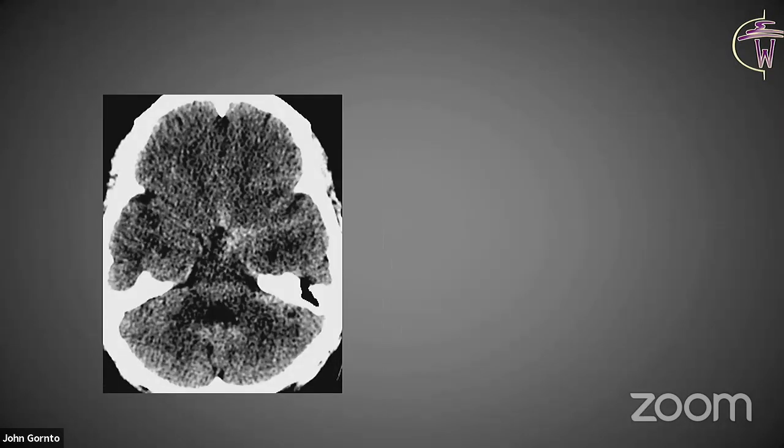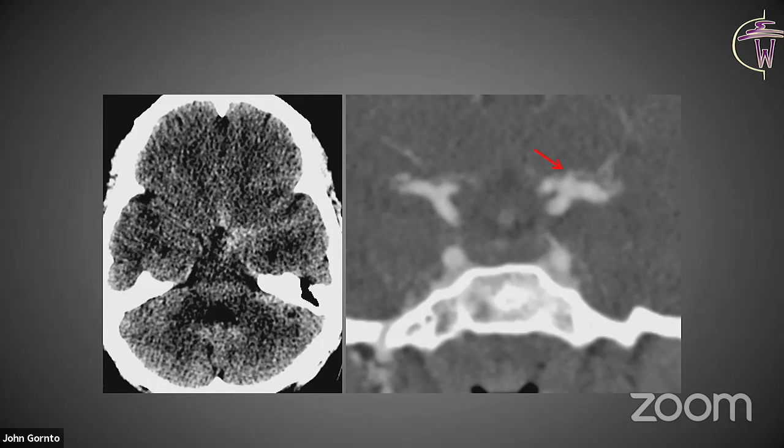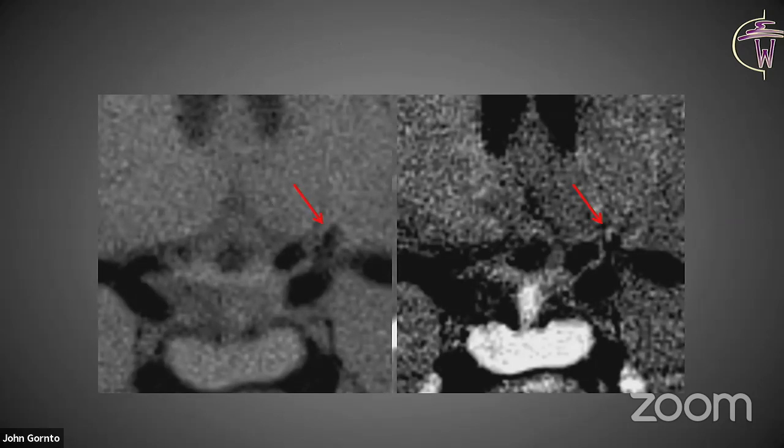And here's another case. The patient had some subarachnoid hemorrhage, and on CTA, there was this little aneurysm, but it looks like there's an infundibulum coming off its tip. You see those little wispy branches coming off of it? That was the neurosurgeon's initial assessment, that this is just an infundibulum, not the source of hemorrhage. They said, let's do a vessel wall imaging study to look for dissection. And on the vessel wall imaging study, you can see that there's enhancement at that cap right there.